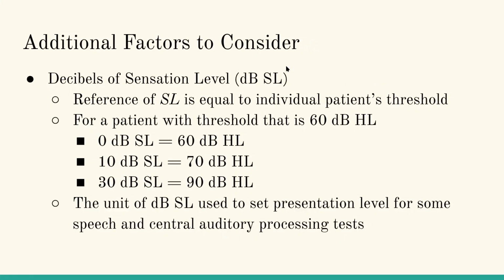Now I do want to talk briefly about decibel sensation level. So when we talk about dBSL, we're talking about what sensation level the individual patient is hearing at. So if a patient has a threshold at 60 dBHL, they have a 0 dB sensation level because it's 0 dB above their threshold.